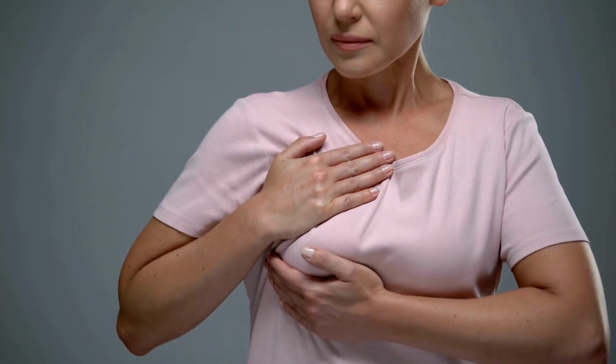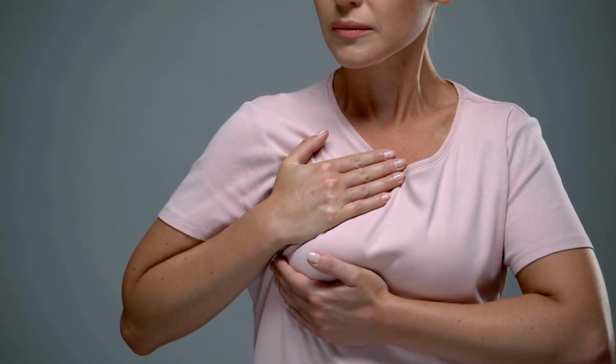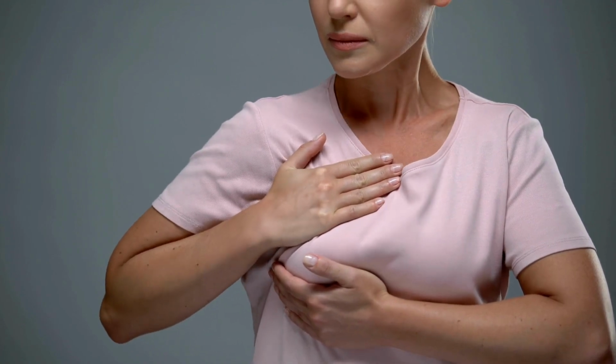There's a downside to it. It does hurt a little more because we're stretching out the muscle. Remember, it's under the muscle. We have to put the implant in. It's going to stretch it out. Weirdly enough, that actually causes most of the pain with breast augmentation as opposed to any incision. That's why dual plane is so popular, and also this is why dual plane is considered dual plane and not truly subpectoral, like under the muscle placement.